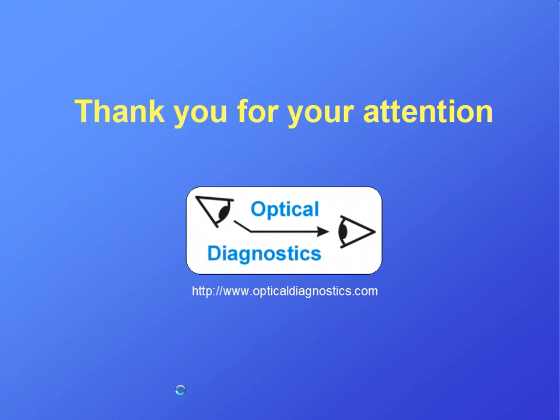You've viewed a brief demonstration of the Color Vision Recorder software. Thank you for your attention.